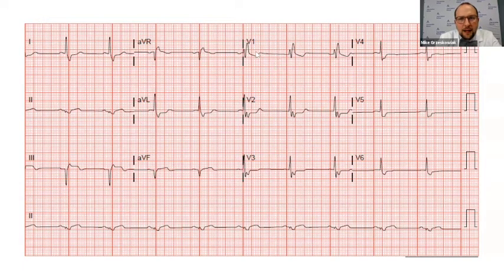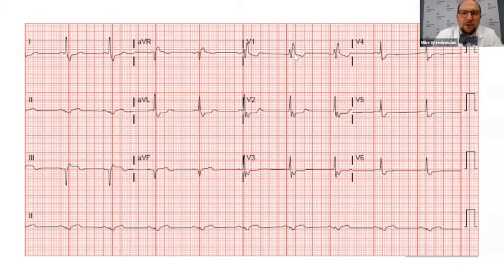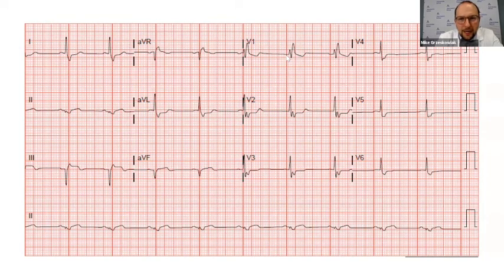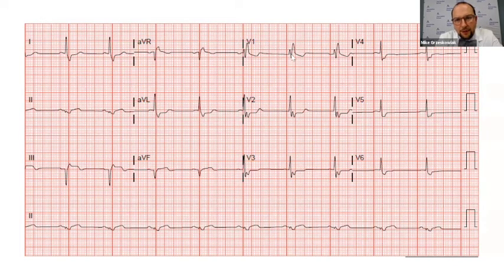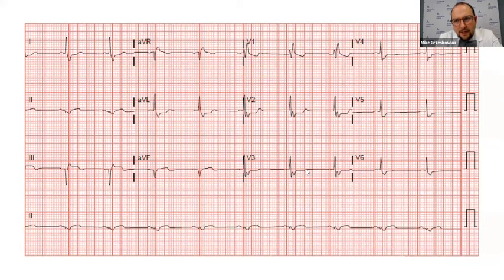Moving to V1, we see a wide QRS complex — more than three boxes, more than 120 milliseconds. This could be a right or left bundle. Since a majority of the QRS complex is above the baseline — it's positive in V1 — this is a right bundle branch block. We see T-wave inversions here. Moving further into the precordial leads, we see some ST depressions, maybe a little bit more, mainly T-wave flattening throughout these leads.